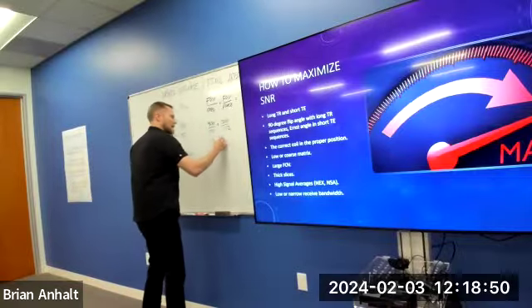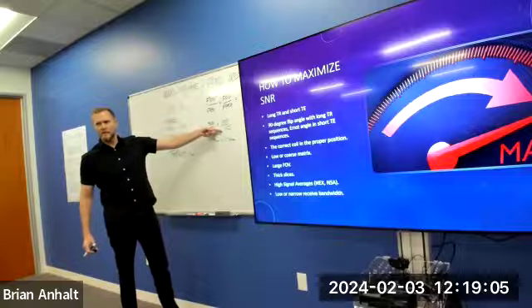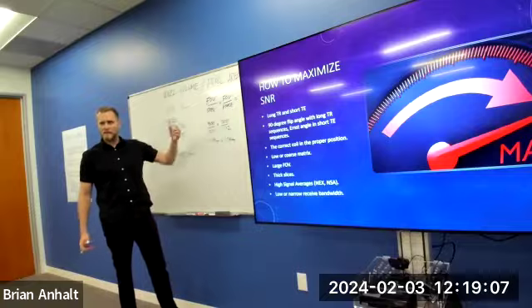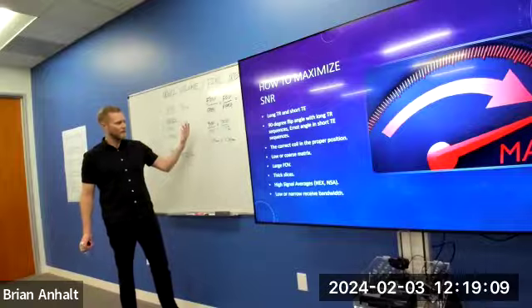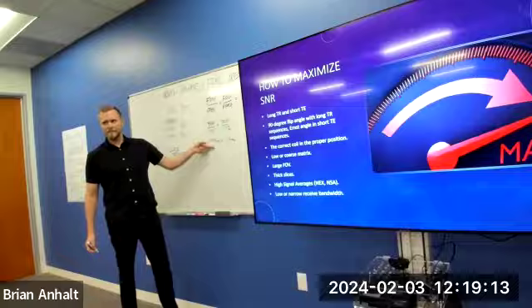And we multiply that by 300 divided by 192, 1.56 millimeters. Obviously, we're cutting it in less pieces. It's more coarse on this side. So we're gonna have rectangular voxels, which is fine, and we do. Just less resolution in this direction than in this direction, right?